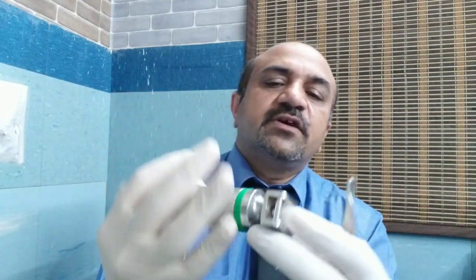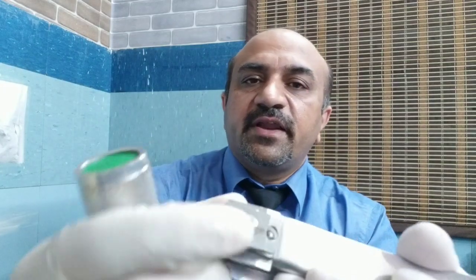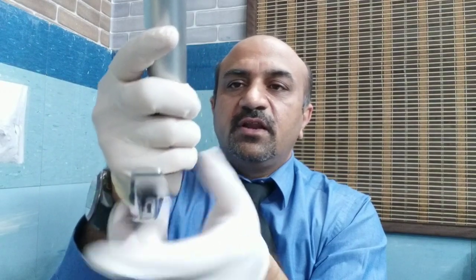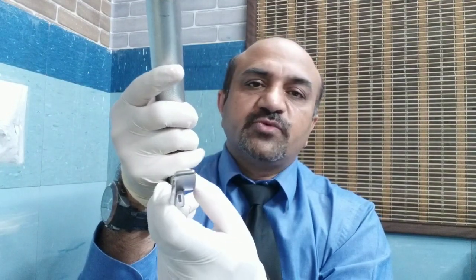Why do we need to attach it? There is a light source, if you can see it here, and there is a connection point for the light source. We just approximate them this way, click it, and snap it back. So here you can see the light, but if I disconnect it, you will see the light going off. So there is a light source in the handle, and it comes through the bulb. This is the direction of the light source.